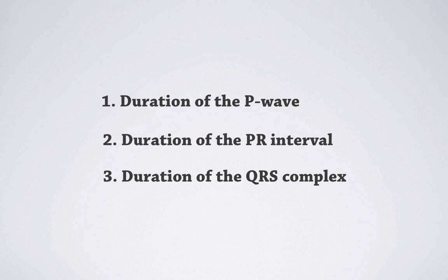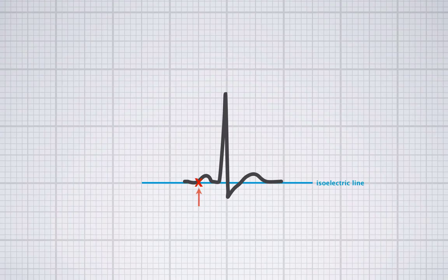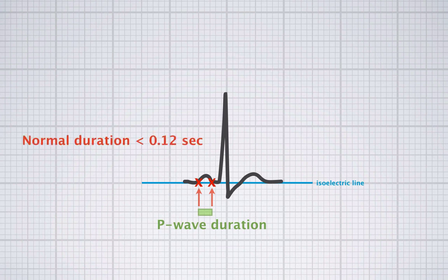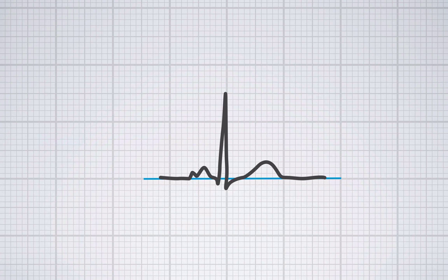Let's first look at the P wave duration. P wave duration starts when the P wave leaves the isoelectric line and ends when it reaches the isoelectric line again. The normal duration of the P wave is below 0.12 seconds. If the atria are enlarged, especially when the left atrium is enlarged, depolarization takes a little longer, and the P wave will therefore also be wider than normal.